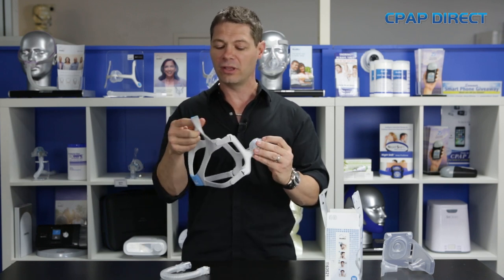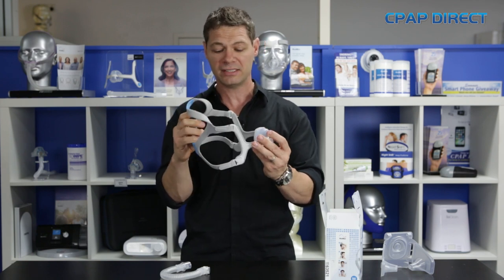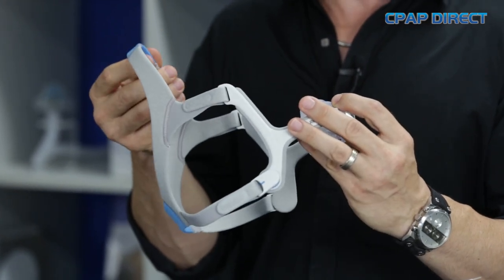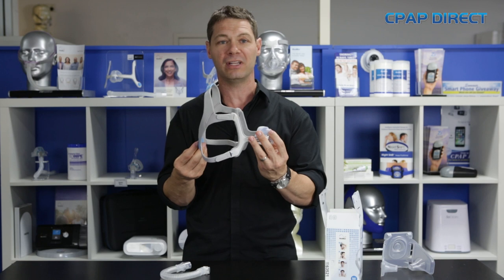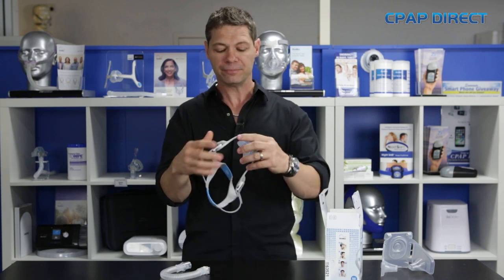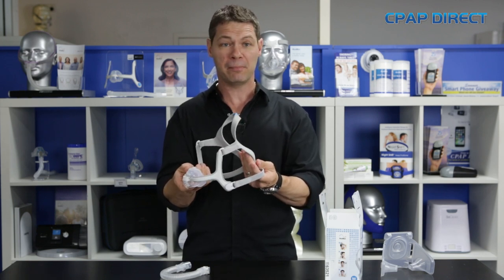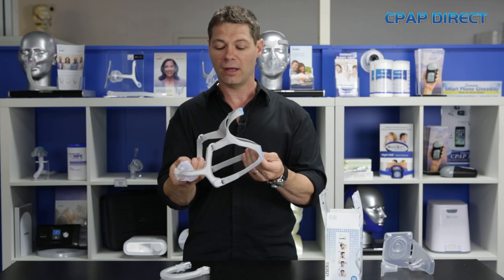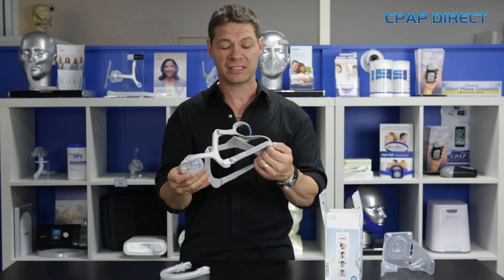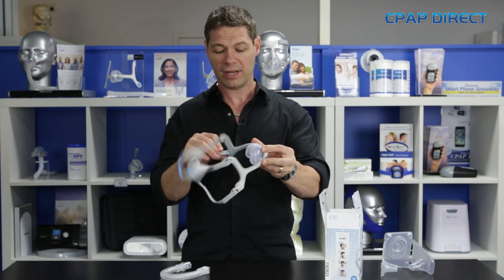The headgear that came with it — bearing in mind this has only just been released — is quite small. So if you've got a really big head, it would really pay to come and have a proper fitting done in one of the clinics to make sure that the headgear is going to be right for you, because we have struggled with some people with big heads. ResMed may change the headgear or bring out bigger headgear for this mask as it rolls out, since they're still getting feedback on how that works.